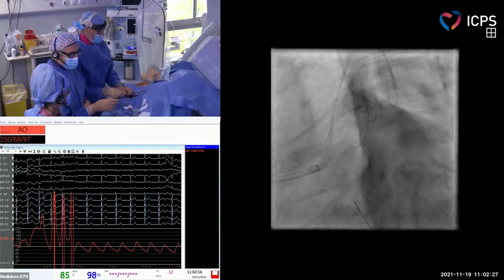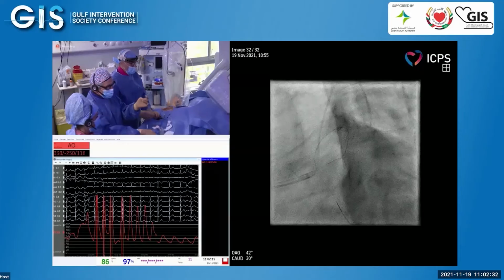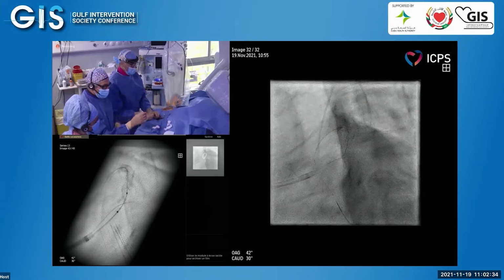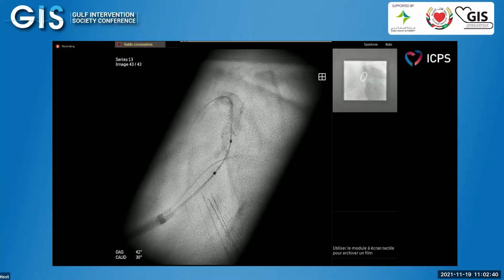In the control room, can we show the stent boost image? If we show the stent boost, it shows it very clearly. Yeah, you can see it clearly. So it's a big chunk of calcium. Okay. So the next step.